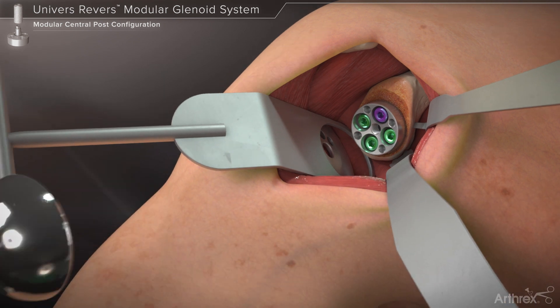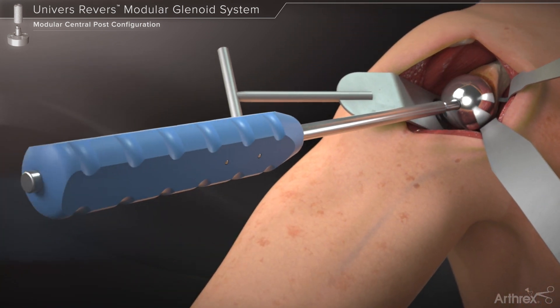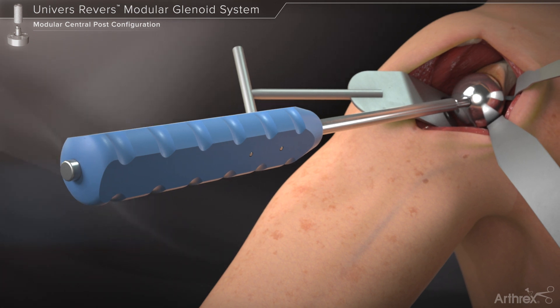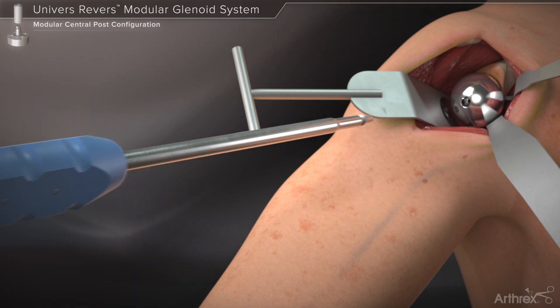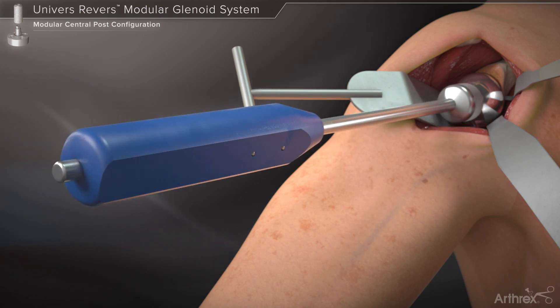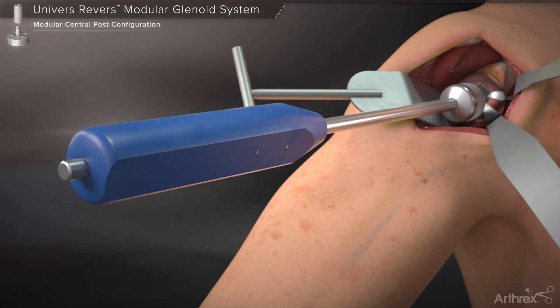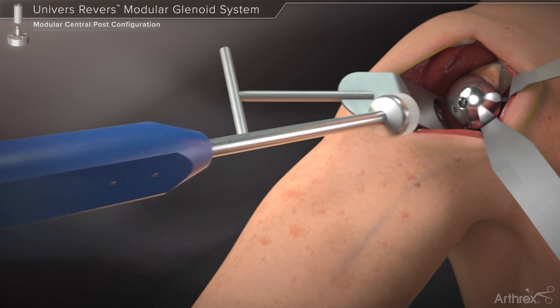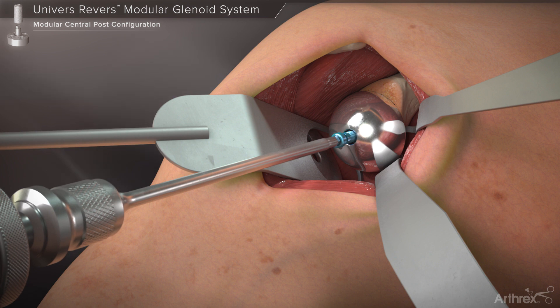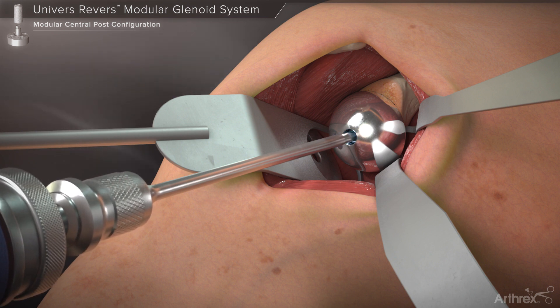A glenosphere is threaded onto the glenosphere inserter and introduced over the base plate taper. Provisional seating of the taper may be achieved by pushing the glenosphere onto the base plate using the inserter handle. Once seated, the inserter is unthreaded from the glenosphere and removed. The glenosphere is then impacted onto the base plate taper using several sharp mallet blows. Finally, the glenosphere locking screw is inserted through the threaded hole within the glenosphere and seated fully using the hex driver.